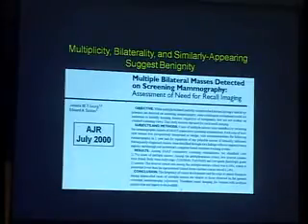Okay. So this kind of, it's been discussed earlier, before 2000, that kind of set the way for what we now apply to screening ultrasound, and certainly screening tomosynthesis, where we see a lot more masses than before on 2D mammography. And also on the multiple foci on MR, perhaps one day, in the contrast work that many of you are doing as well. Like, a lot of them, they're all circumscribed, maybe that's all okay.